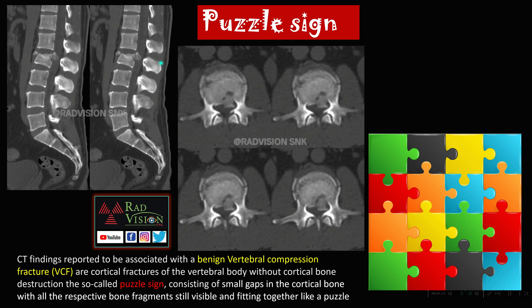Next is the Puzzle Sign, seen in benign vertebral compression fractures. You can see there are multiple gaps between the fracture fragments, but all these multiple fracture fragments are still visible and fit together. This mimics a puzzle, where multiple components align to form the complete picture. Here, multiple small gaps in the cortical bone are present, but the fragments still fit together like a puzzle. This classical Puzzle Sign helps differentiate benign from malignant vertebral compression fractures.